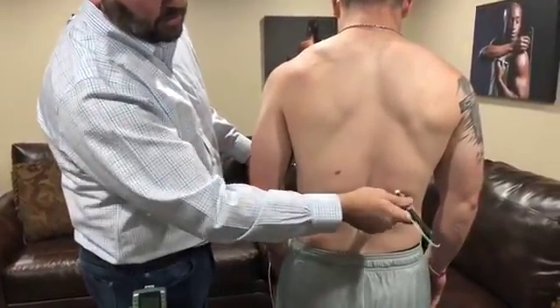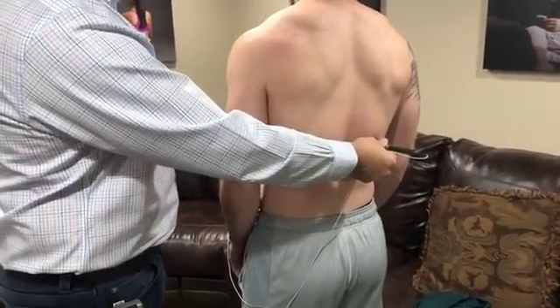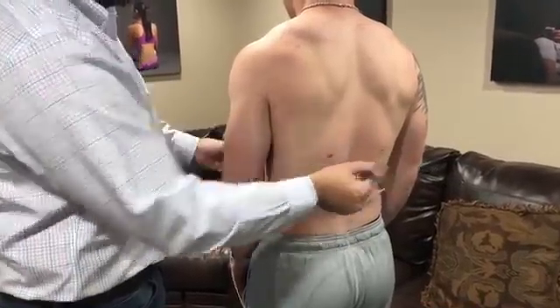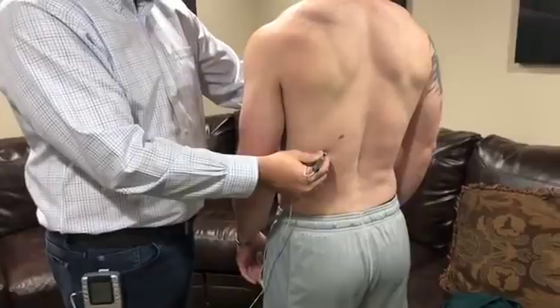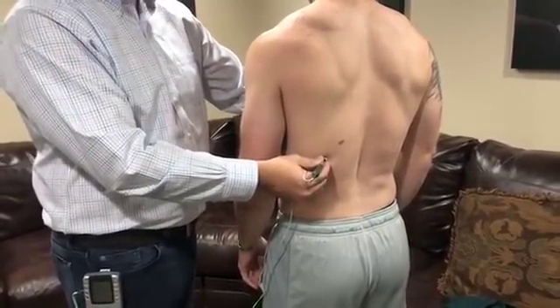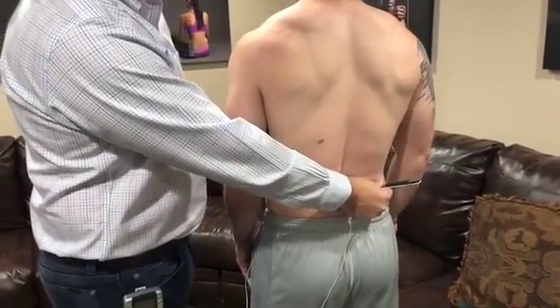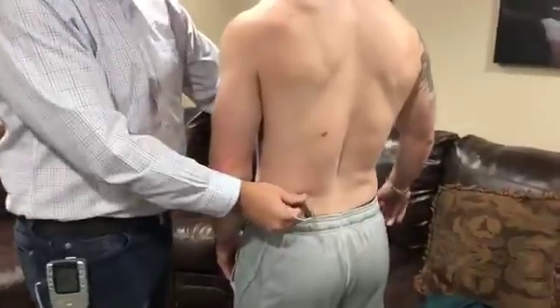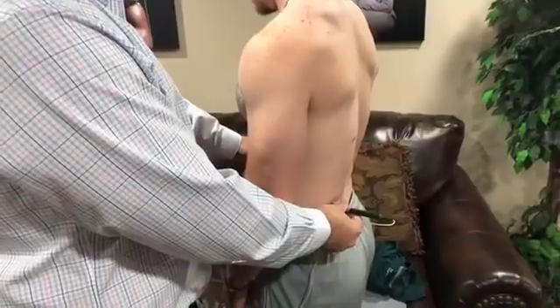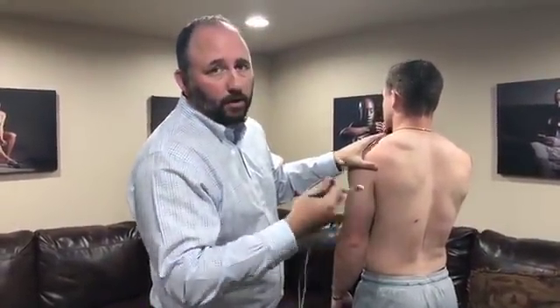We'll do one slightly above the indicated pain level for 10 seconds, then switch sides. Laura has asked if this would be helpful for lumbar compression fracture, and Katie has asked if she can use it for chronic lower back pain. Yes, in both cases. When we treat pain, it doesn't matter as much the etiology — whether it's lumbar fracture, musculoskeletal, CRPS, or any type of injury, you can still get good relief. The key to know is we're not treating the injury, we're treating the pain. That doesn't mean you can go out and do squats or run a marathon — you still have that injury. But you can use this for chronic pain, acute pain, whatever the case may be.